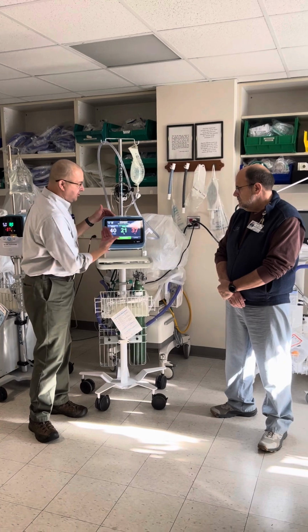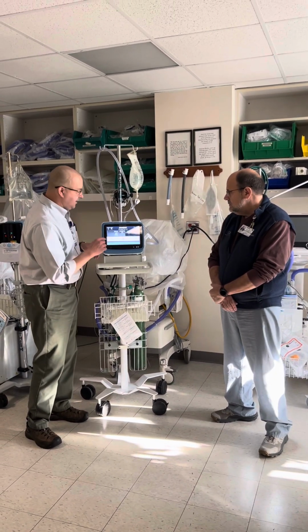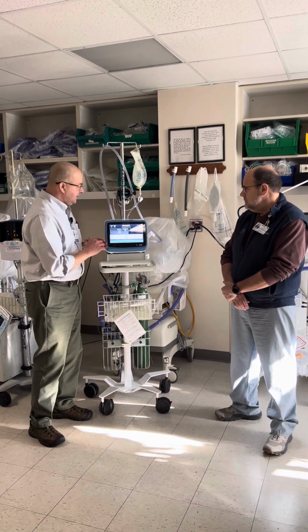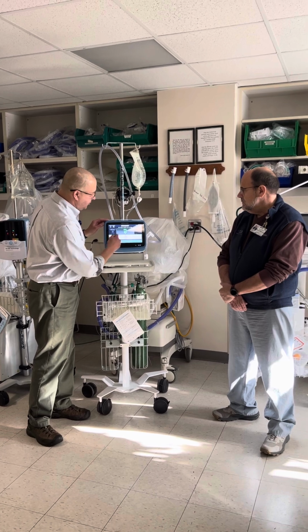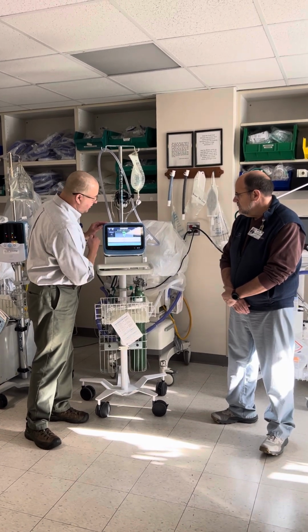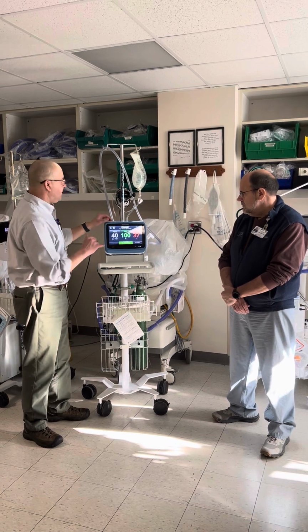We have much larger numbers. We still have colors. Everything is touch screen and scroll. So everything we talked about before is the same. We can absolutely turn the FiO2. We can start all the way, if you scroll across, at 100%. We can go all the way down to room air.